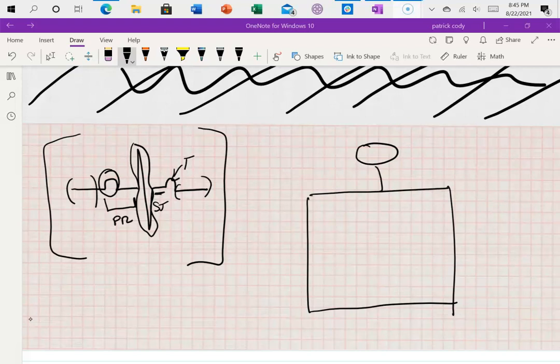So anyway, all that to say this, in our standard ECG, right now we're talking about single lead ECG, we have a couple of different electrodes, and by way of definition, an electrode is something sticky that conducts electricity, or in this case records electricity. Okay, and it's important to recognize that in some cases the electrode and the lead will be named the same, and other times they will not be named the same. And we'll get more into that nomenclature when we get into 12-lead ECG later in the series. But for now, what I want you to recognize is this.